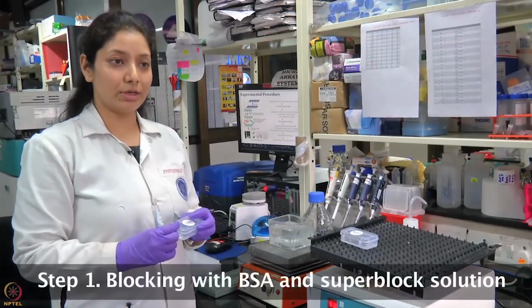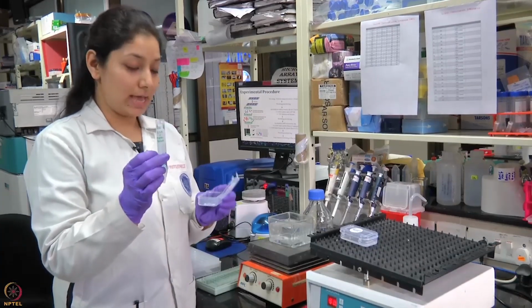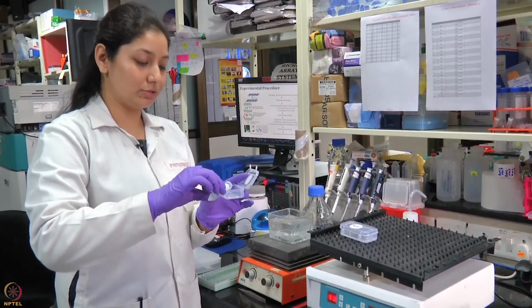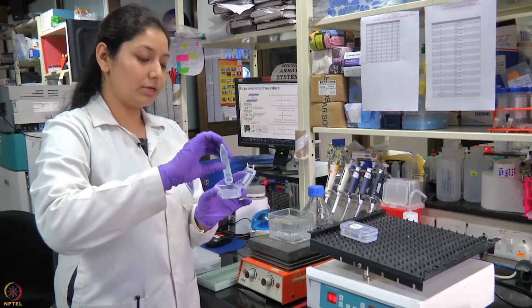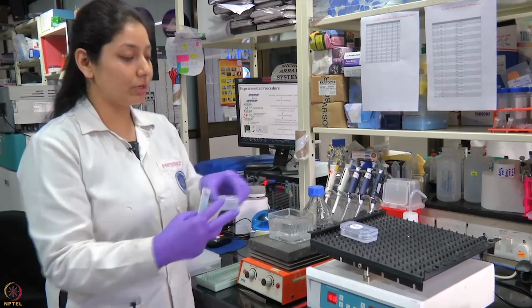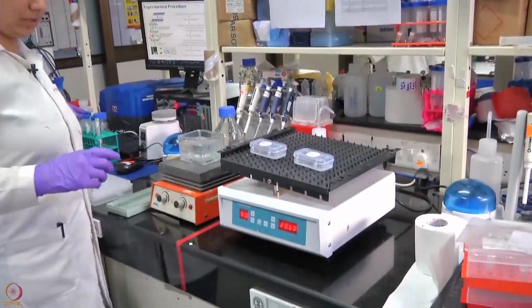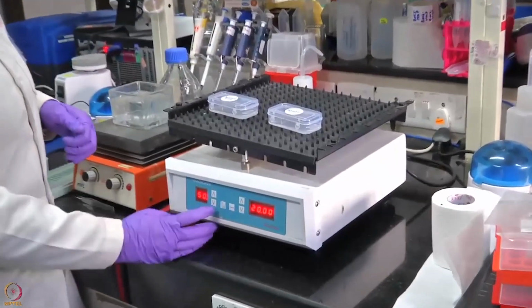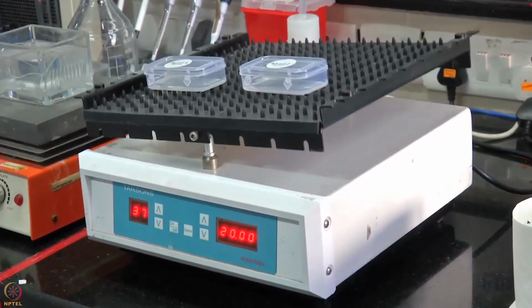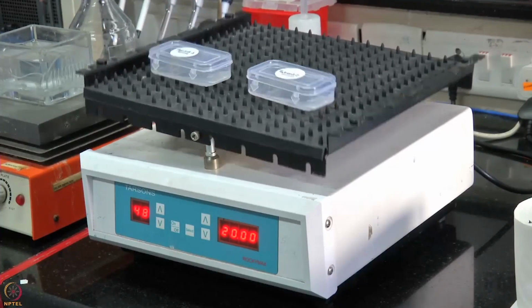The first step is blocking of the slide. For that we use BSA and superblock solution, and this is the slide in the box. We just pour the BSA and superblock solution onto the slide. Make sure that you put it on the barcode region, and then the slide is kept for incubation for 2 hours, so that all the extra spaces except for proteins are blocked properly. This is done using a rocker, and we start it, and the rocker keeps on moving for 2 hours. The blocking is done. Speed is kept as such. The slide is covered properly with the blocking solution.